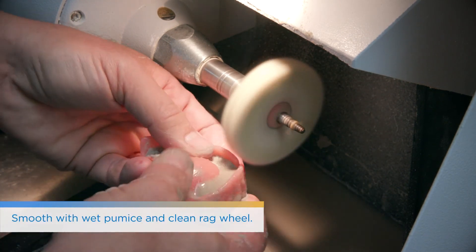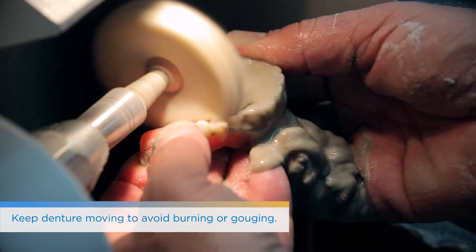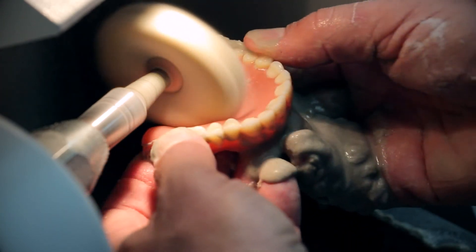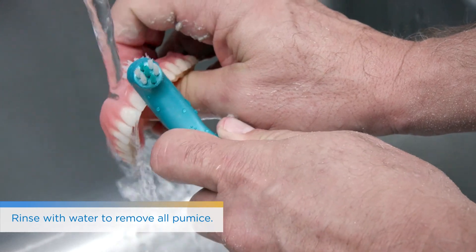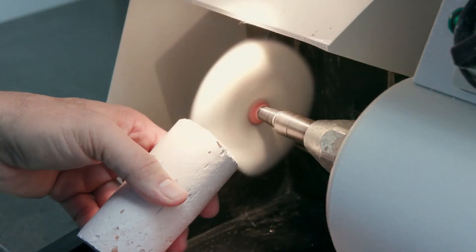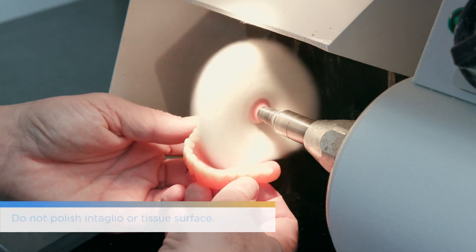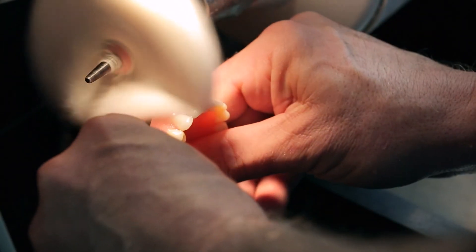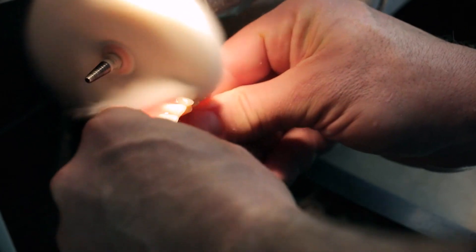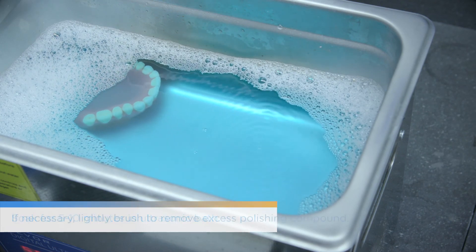When it comes to polishing — whether it's pumice or high shine — whatever you typically use with your analog dentures, the same rules apply here for the Lucitone Digital Print denture. A bristle brush works nicely to clean around the teeth. Then go in with pumice and a clean rag wheel. You may need to push a little bit more than you're used to with traditional dentures because of how strong the material is — but you're not reefing on it. Remove all extra pumice, then use a high-shine acrylic polishing compound to get that nice denture shine. We don't recommend polishing the intaglio or tissue surface — just the facial aspect and teeth. Finally, soak for 5 to 10 minutes in an ultrasonic bath, avoid the steam cleaner, and use a light brush to remove any excess polishing compound. That has been the Lucitone Digital Print training — thank you so much.